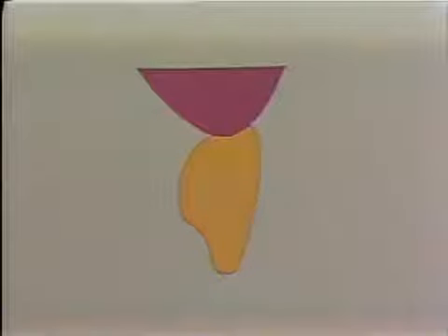This diagram shows a maxillary central incisor Pontic situation on which this would be labial and this would be lingual over here. And this represents the gold core which has to be made for the porcelain to be fused over this. And if we can now look at the porcelain situation in relation to the gold, you can see from this diagram where the porcelain area is just fading in and out, the relationship of that porcelain to the gold core.